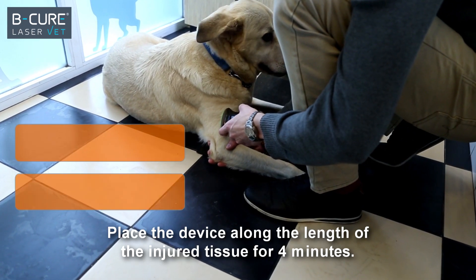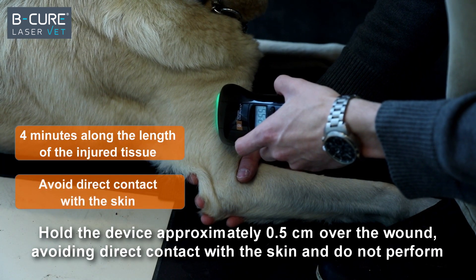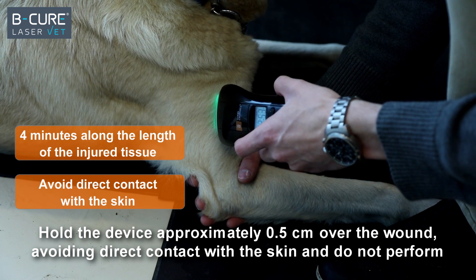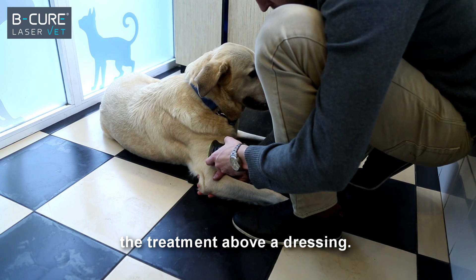Place the device along the length of the injured tissue for 4 minutes. Hold the device approximately half a centimeter over the wound, avoiding direct contact with the skin, and do not perform the treatment above a dressing.